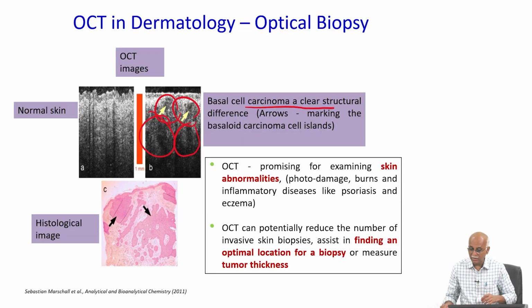And we will continue in the next class, where we will try to see some of the applications quickly. Before we go tomorrow, we will move towards therapeutic applications. It is not to measure some characteristics or observe tissue characteristics, but if we can use it to change the characteristics of the tissue using these optical sources. So, such therapeutic applications also we will try to see as a biophotonics device.